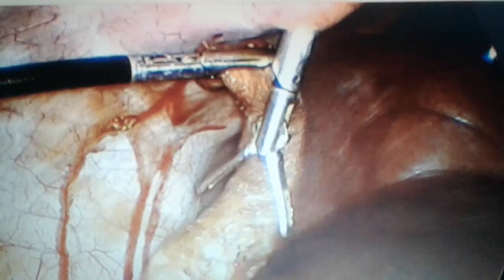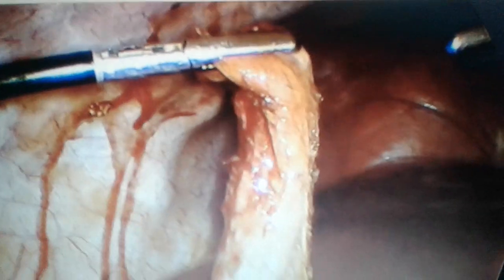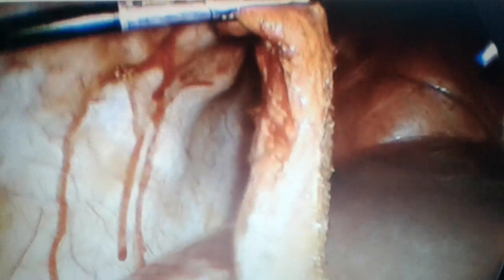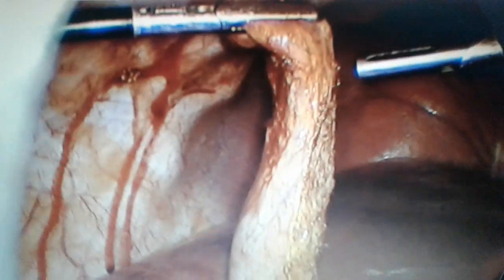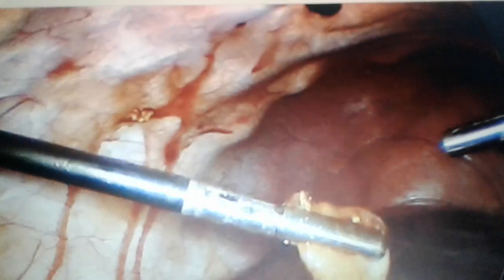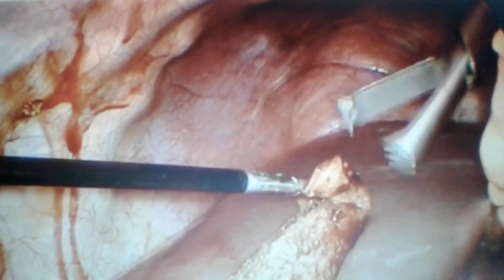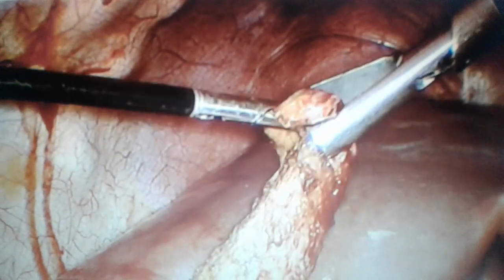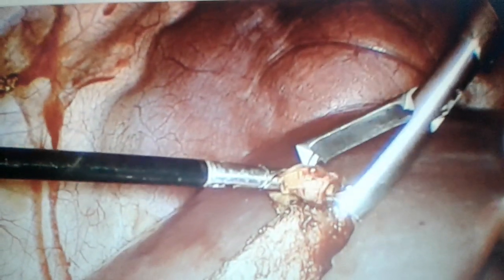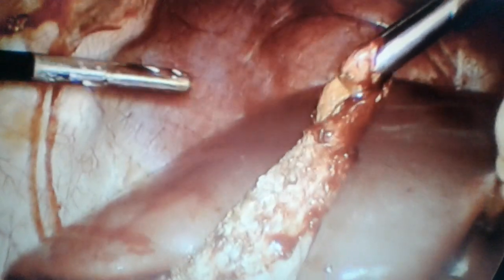Now the next important thing is, in most of the Western countries, now that the gallbladder is out from the gallbladder bed, it is mandatory in most of the countries outside India that the gallbladder removed from the gallbladder bed should be taken out from the peritoneal cavity in an endo bag.